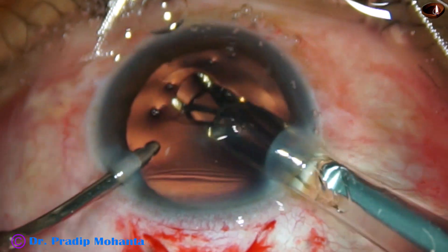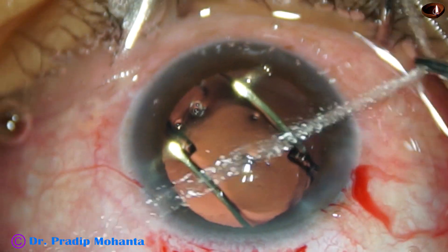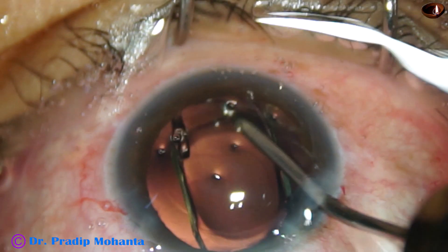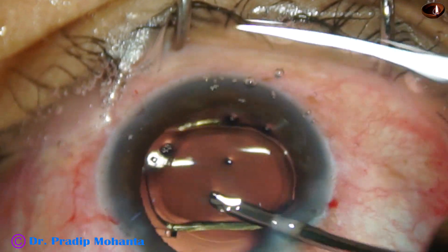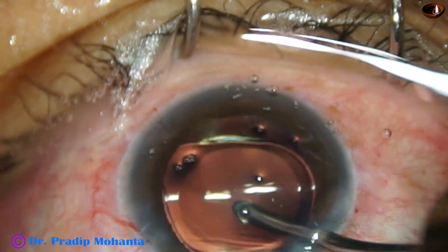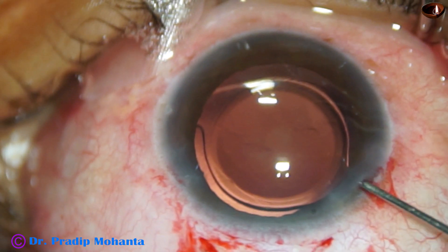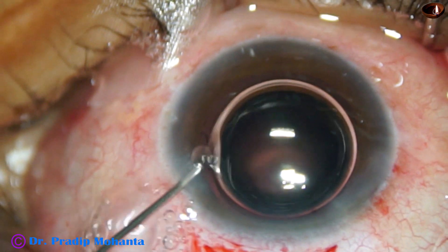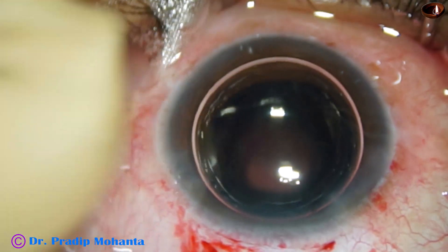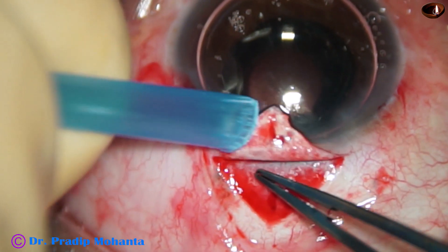A hydrophobic acrylic intraocular lens is implanted using irrigation. Because I want to use pilocarpine — if I use viscoelastic, I have to remove the visco and then use pilocarpine. Inject a bubble of air and then inject pilocarpine.